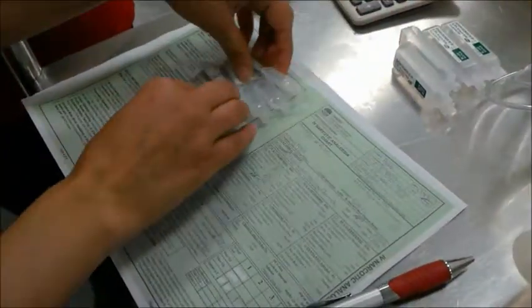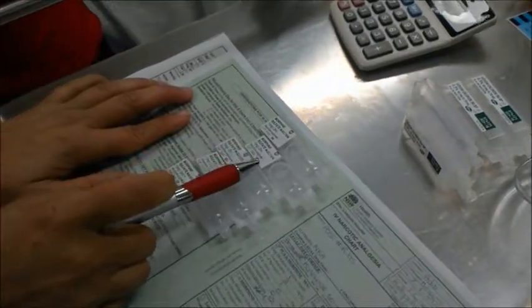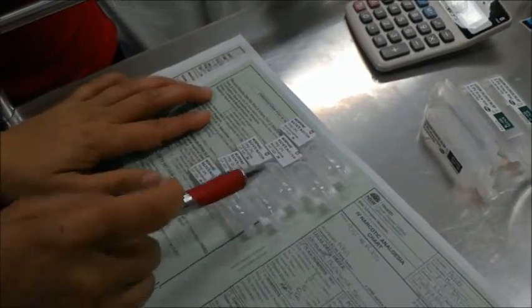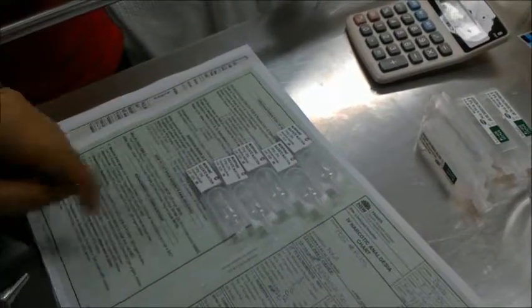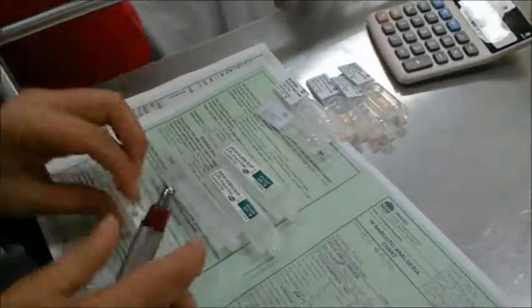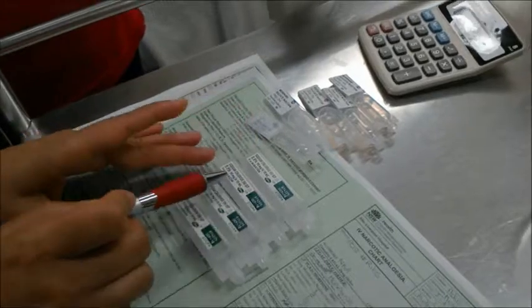These are the ampoules. I have morphine drugs. I have used 5 ampoules today. Morphine sulfate comes with 10 mg 2 ml, expiry 1020. They all are within the date. Also, I have used normal saline to make it up to 50 mils. Sodium chloride 0.9, expiry September 18.